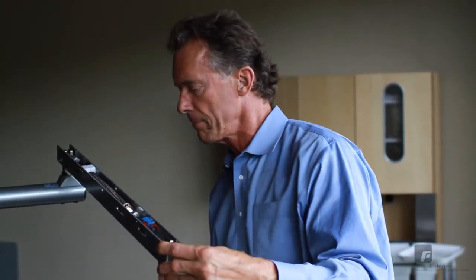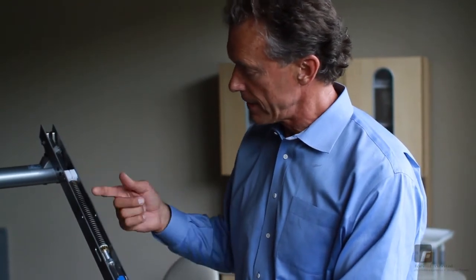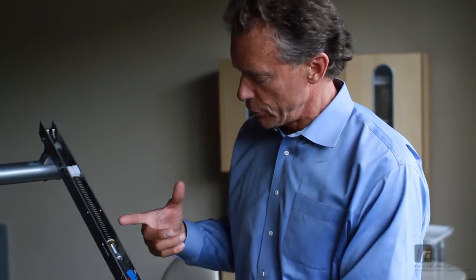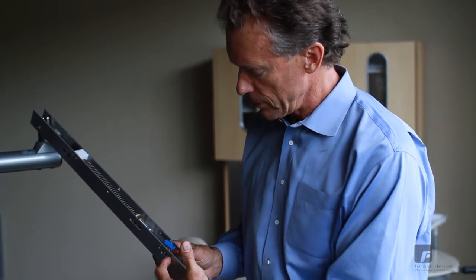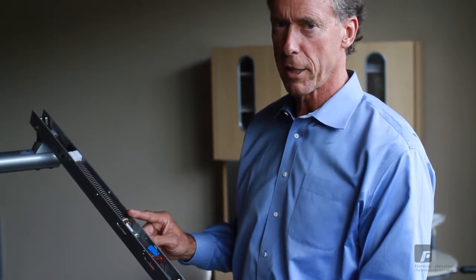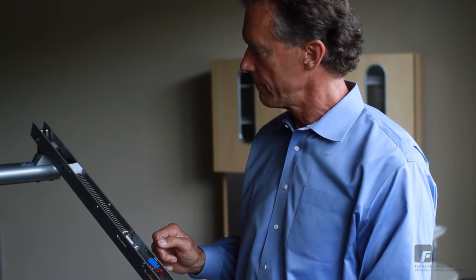The housing is easily removed just by sliding it back. And then inside you have a spring that is very easily adjusted. So if 10 or 15 years from now the spring gets loose, it's easily tightened by just rotating this wheel on the shaft. To change the position at which the light comes on, through this hole here, you can access 2 set screws and move the mechanical switch up and down on the shaft. You probably should unplug it before you do this, but I'm not going to stick my finger in there to adjust it, so I'm safe there.